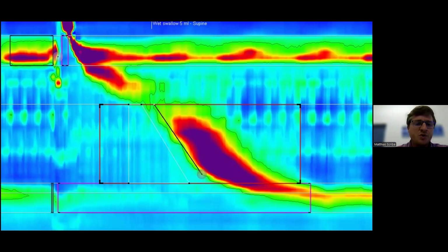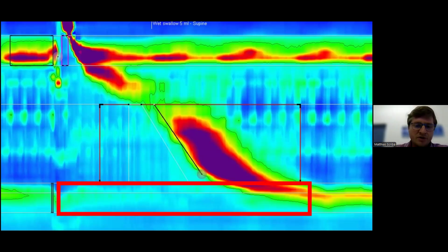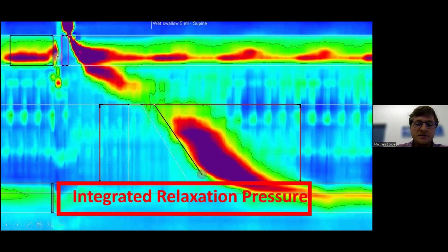The first and most important metric is always this box, this 10-second box down here, which is measured from the time the swallow begins. So there's a vertical line drawn here for the next 10 seconds. And what is that? This is called the integrated relaxation pressure, or IRP. This is basically looking at how much maximally your lower esophageal sphincter relaxes when you swallow.